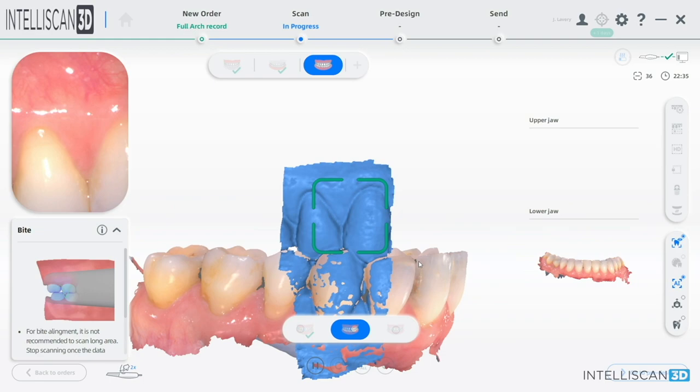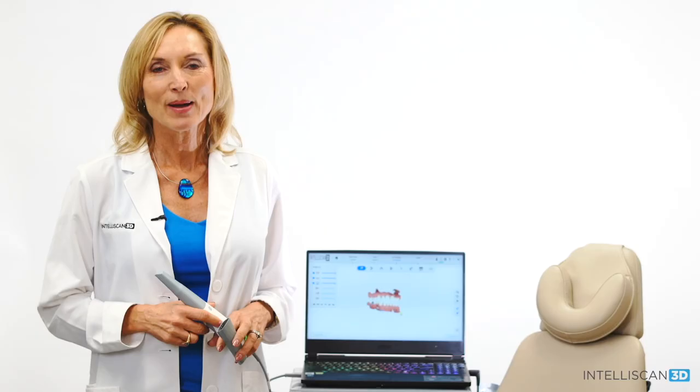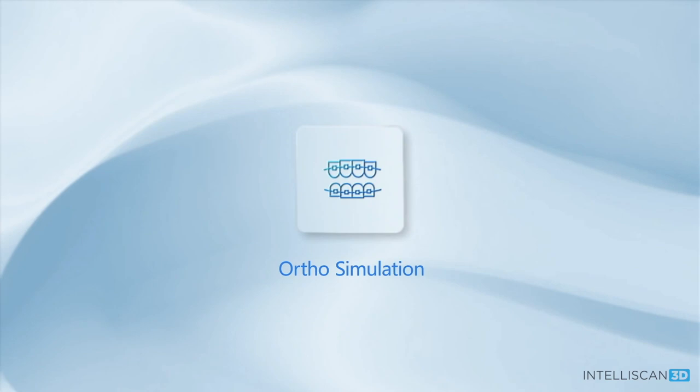The artificial intelligence function lets the software detect but ignore useless data, such as tongue, cheeks, and fingers. Once both arches are completed, the alignment between the two arches is going to be incredibly fast. Orthodontic simulation: this new feature does an amazing job realigning the patient's teeth automatically to demonstrate how their teeth can be straightened with clear aligners.